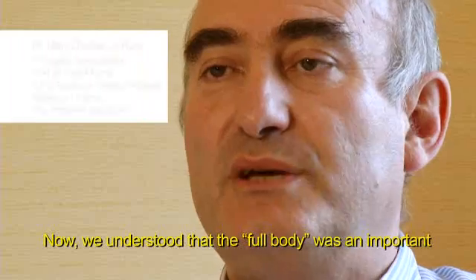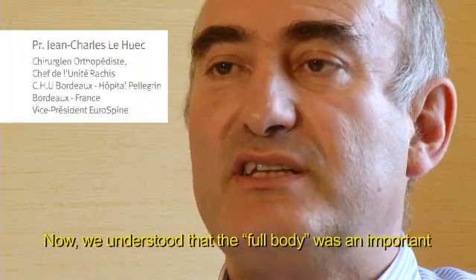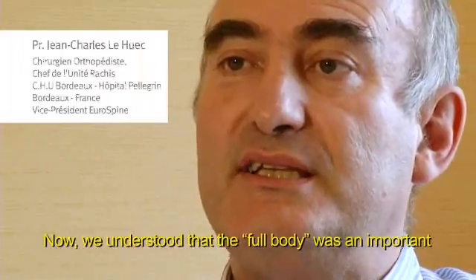With that unique ability to analyze the entire body simultaneously, the AP and lateral images will provide a definite means of figuring out all of these interrelations, which I think are critical to the true understanding of spinal pathology and ultimately spinal treatments.